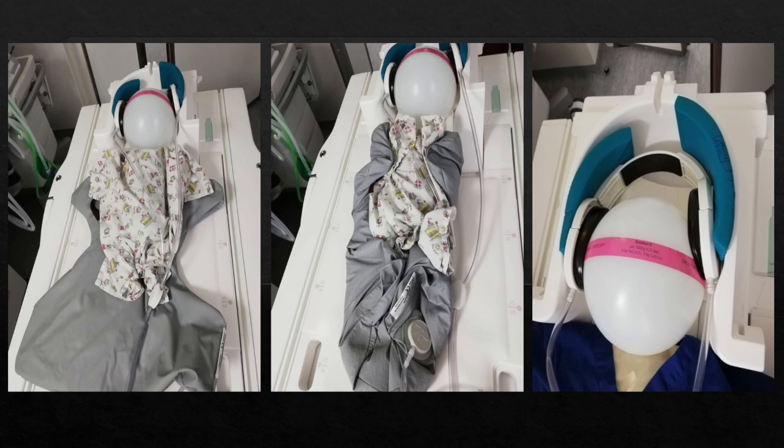So this is just a little example. Unfortunately, we couldn't use a real person, so please excuse our crude mock-up of a patient. So here we have an example of the vacuum cushions that we use. That plugs into the table in the inbuilt vacuum socket, and then it's sort of like a little bean bag, sucks all the air out, and then that keeps the patient really nice and still and restricted. And then an example of the sponge cushions with the headphones on, that helps to restrict as well. And then the additional sponges, which really helps minimize the amount patients can move.